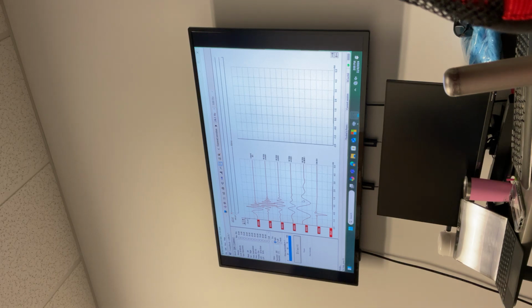So the chirp stimulus, because of the traveling wave compensation, is shown to result in larger amplitude, lower threshold. With larger amplitude, you need fewer sweeps, and the thresholds are lower. In your lab, lab 5 and lab 6, you have to compare, is there any benefit of doing chirp? How is the response compared to tone burst? And how does it compare to pure tone thresholds? Okay.